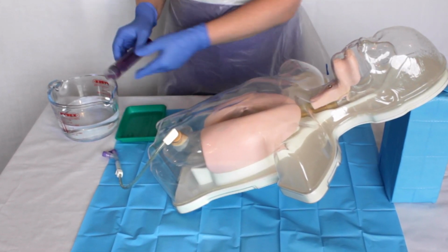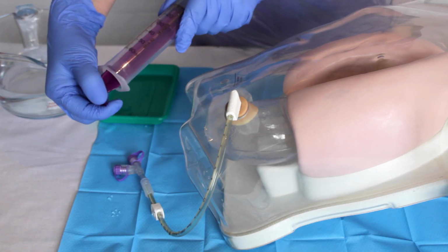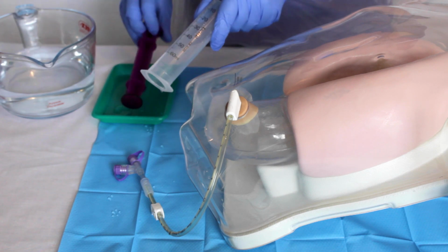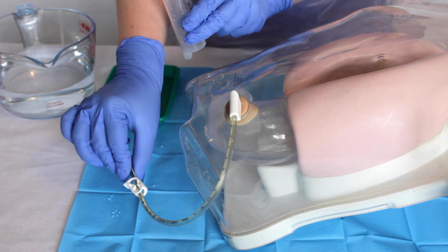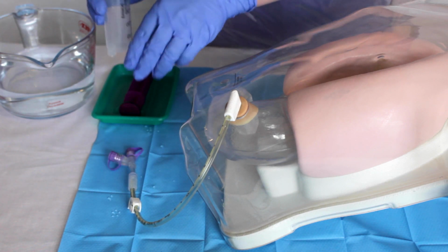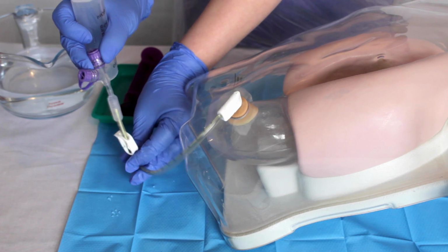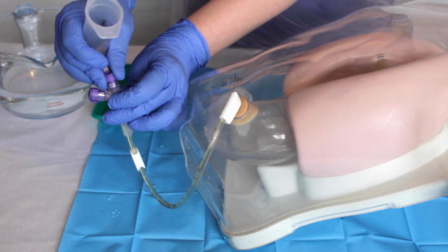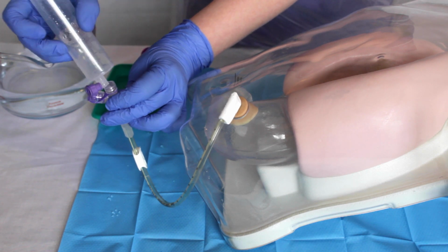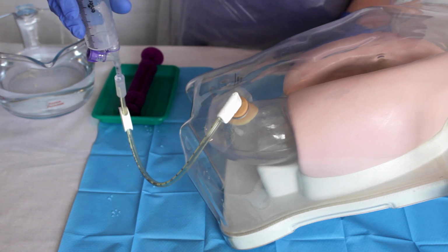To administer a water flush using the gravity method, remove the plunger from the syringe barrel. If present, ensure the feeding tube clamp is closed before removing the cap from the tube. And if no clamp is present, ensure to kink the feeding tube between your fingers in order to stop leakage. Connect the syringe to the feeding tube, being careful not to over-tighten.